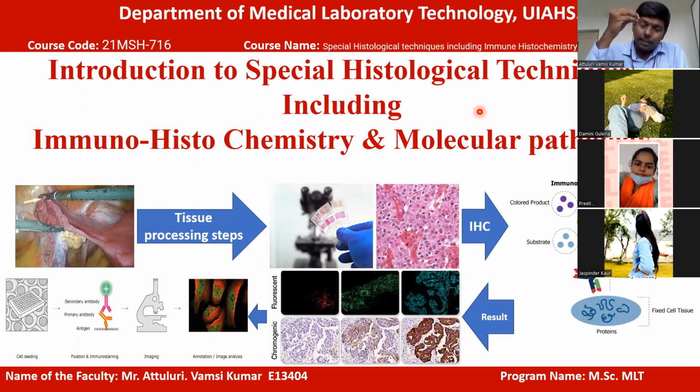And it has tremendous applications. By understanding the functional status of the enzyme, I can draw conclusions about cardiac activity, the possibility of getting heart attacks in the patient. So understanding the functional status of enzymes in the tissues has its own broad applications and uses. And what type of methods, procedures, protocols, tools can I use in order to assess the functional status of enzymes within the tissue?